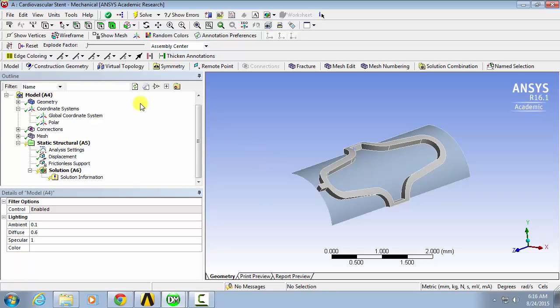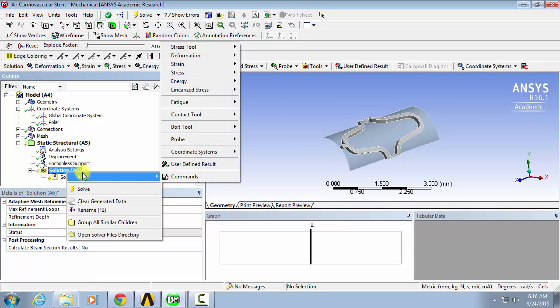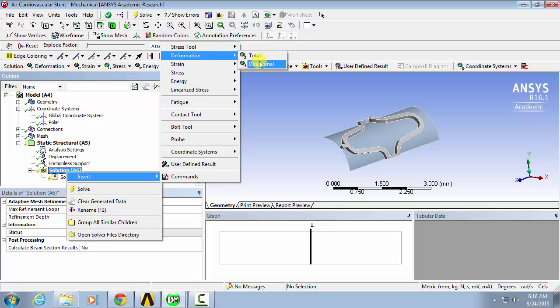So first, to measure recoil percentage, we'll go to solution and insert deformation directional.